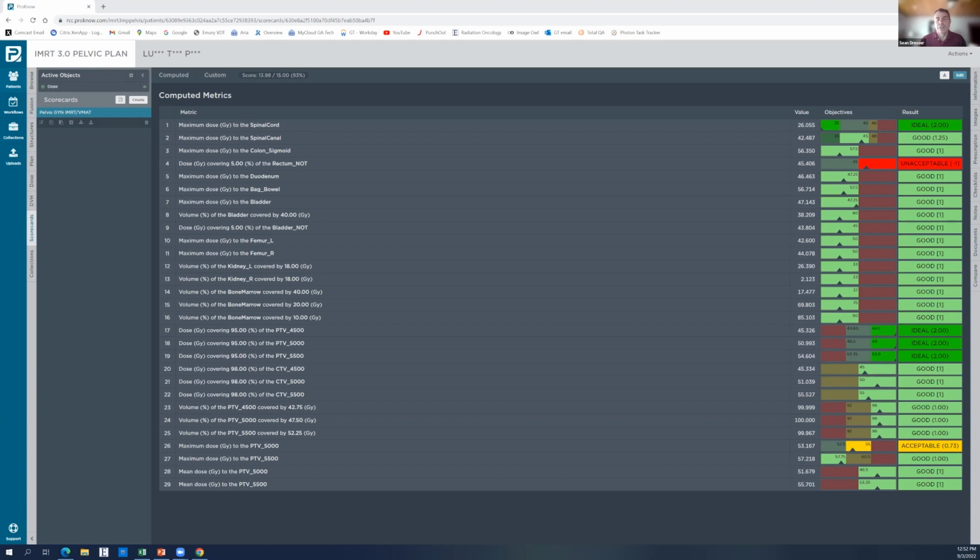Well, yes and no. Our preference is always to start with VMAT. And this is a thing in the US, treatments are driven a lot of times by insurance. So we'll start with the most ideal or standard of care, which is VMAT. And if for some reason the patient's insurance doesn't allow it, we'll have to resort to 3D. That's usually our decision tree on the mode of treatment. By and large, VMAT, at least for us, is considered a standard of care. So it's rare, unless it's a true palliative case, that they would deny that.